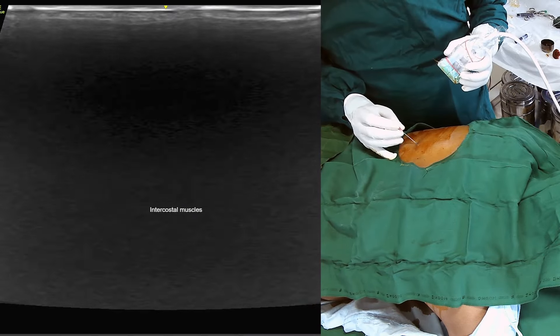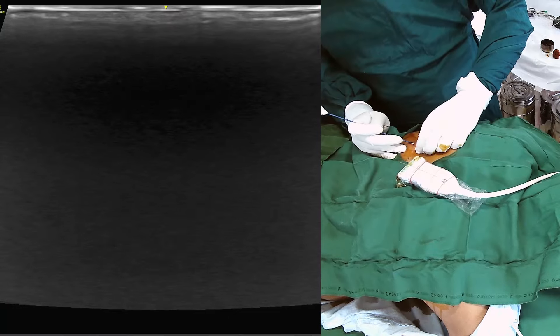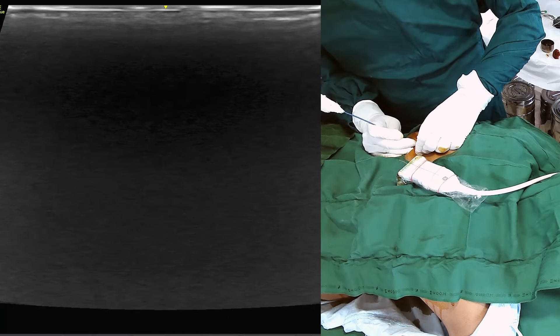A high-frequency ultrasound probe is then placed in the mid-scapular line. The rib and pleura are identified.